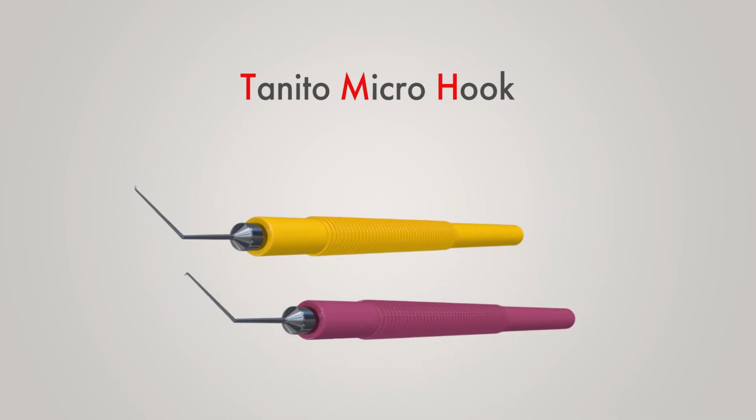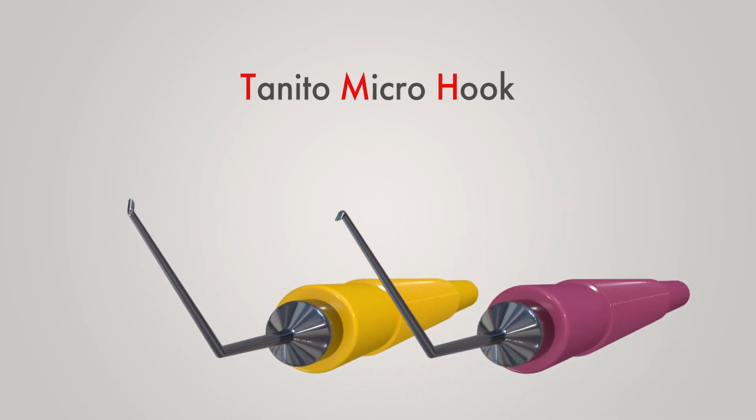There are several other hooks for trabeculotomy surgeries, but the TMH has a smaller tip, small enough to enter directly into the Schlemm's canal. It is sharper too, so the trabecular meshwork can be easily incised by moving the hook circumferentially. The spatula-shaped micro-hook makes it easier to insert it into the Schlemm's canal without the need for creating an entry site. This both simplifies the surgical procedure and shortens the time.